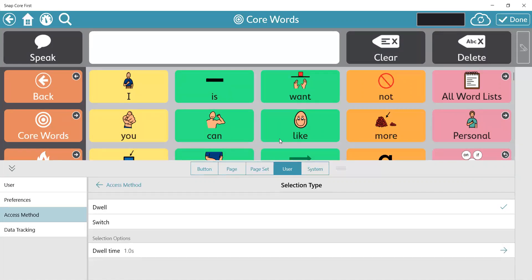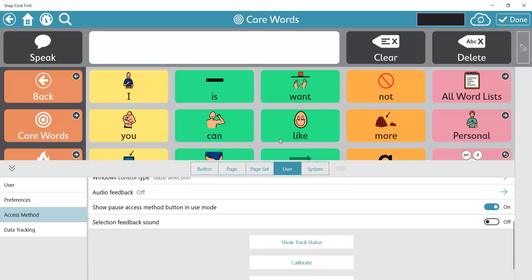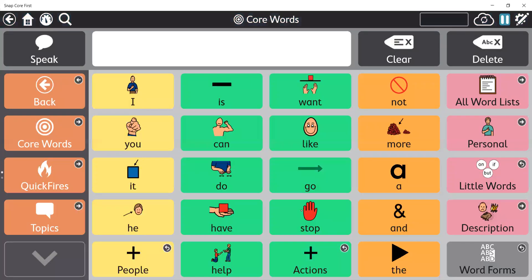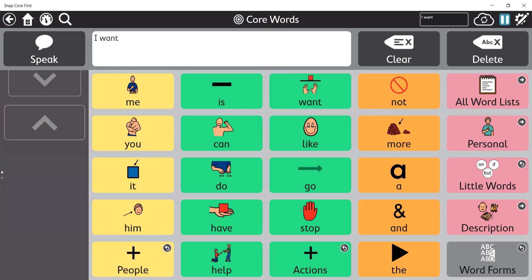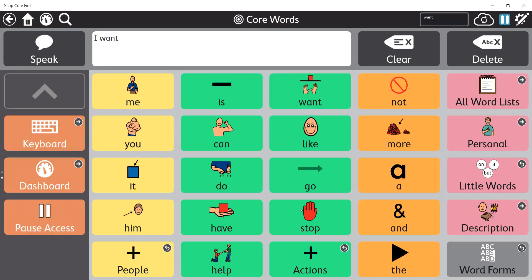I can bring up my track status box to make sure I'm in the right position, close that out, and then done. This allows me to click around with my eyes, I can even scroll down, and I can pause my access so that I am not using eye gaze while I'm scanning my page.